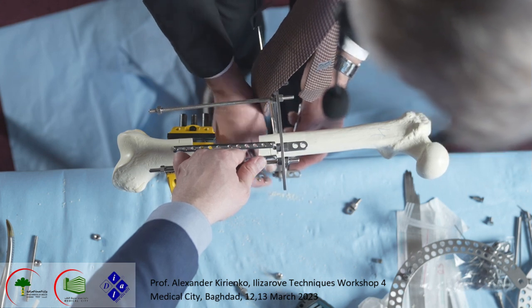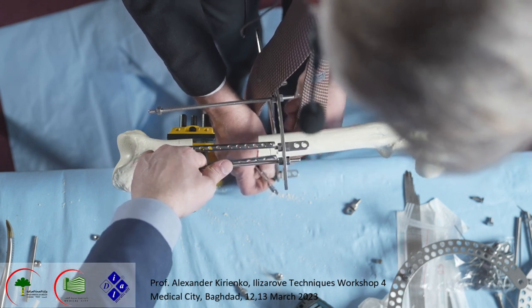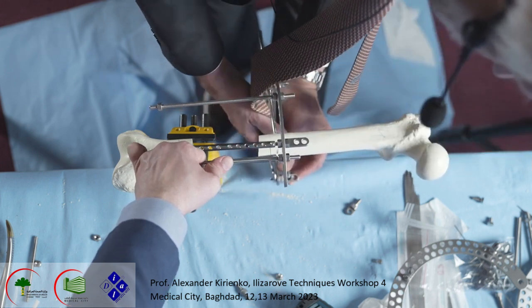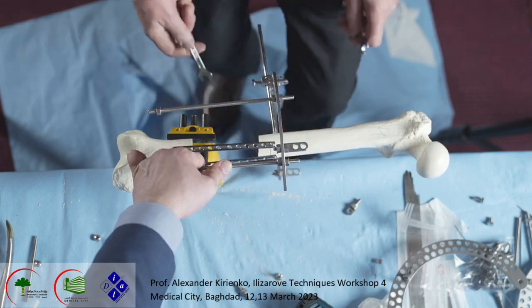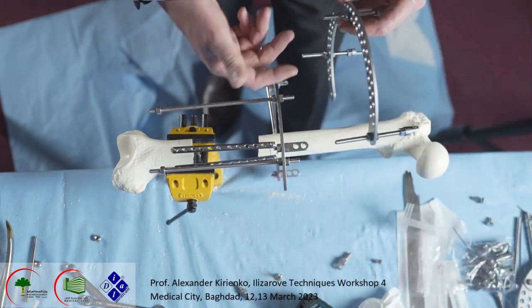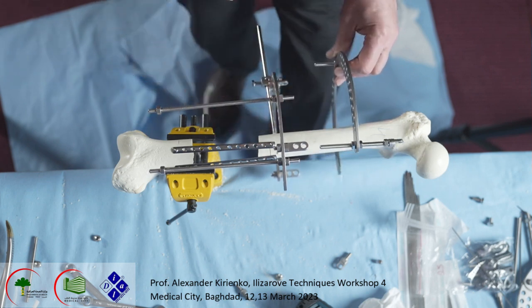Now this is a second. Okay, they should look one to another. Okay, like this. After that, I know that for my proximal ring we have much more muscle here. This ring should be displaced just a little bit lateral.